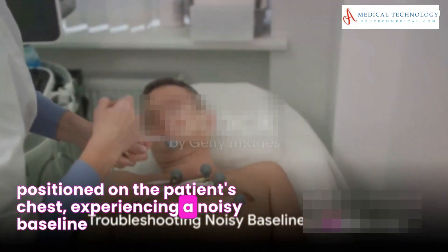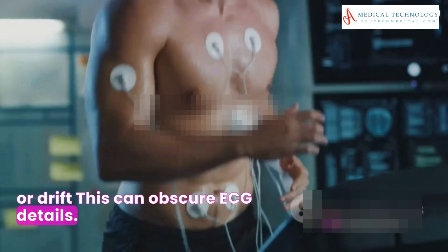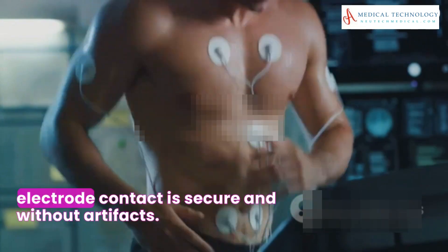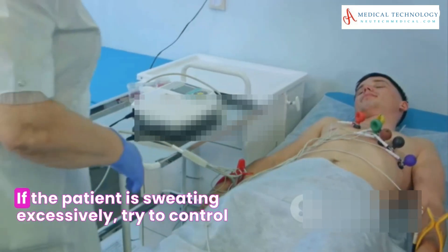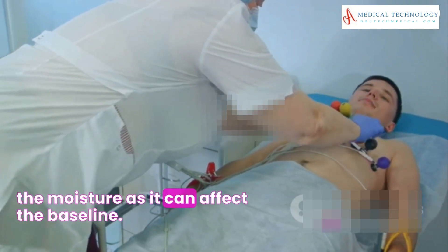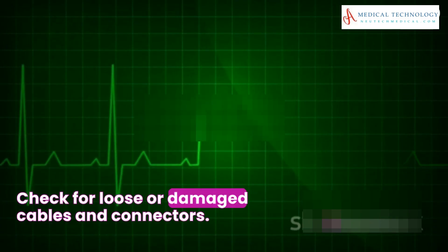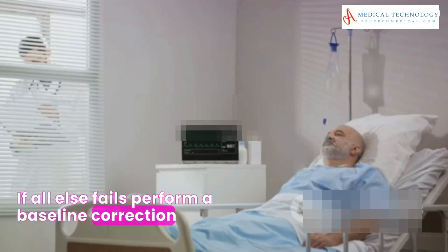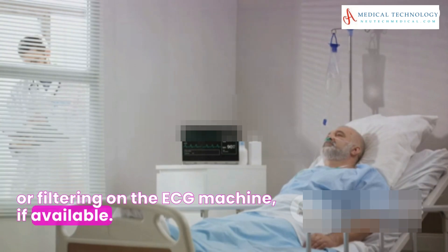Experiencing a noisy baseline or drift? This can obscure ECG details. Check that the electrode contact is secure and without artifacts. If the patient is sweating excessively, try to control the moisture as it can affect the baseline. Check for loose or damaged cables and connectors. If all else fails, perform a baseline correction or filtering on the ECG machine, if available.